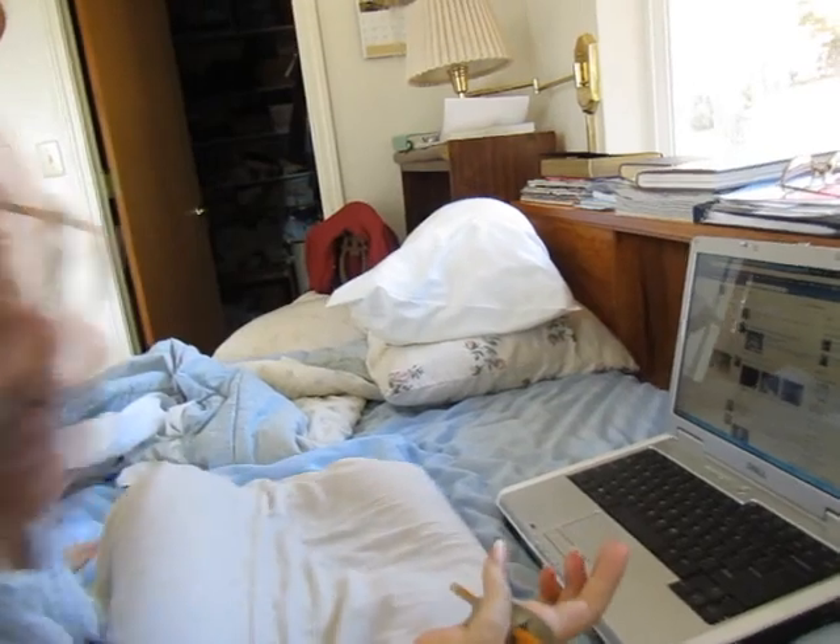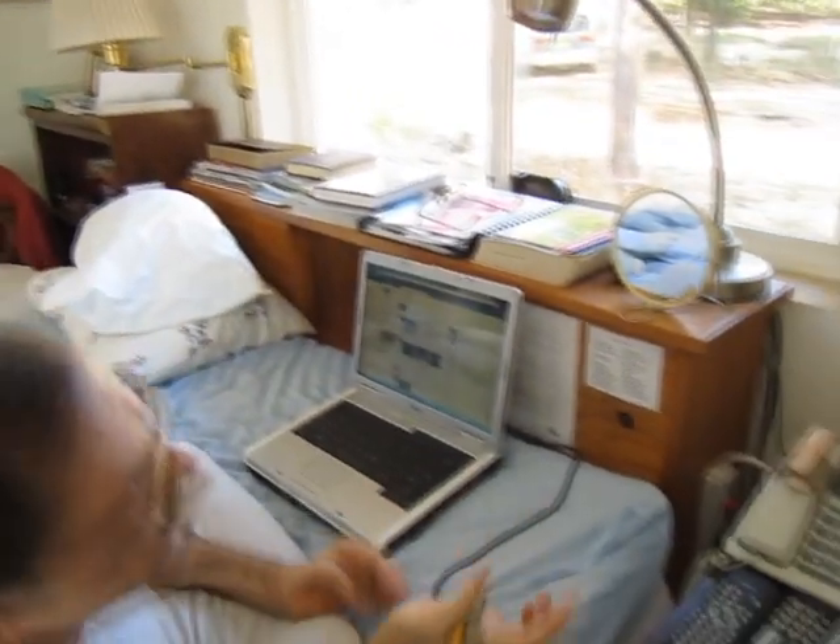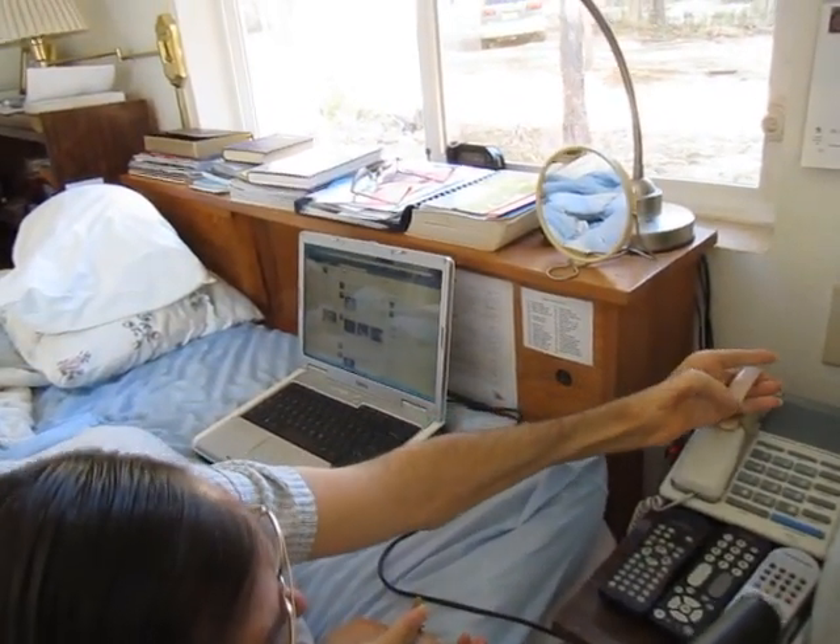The phone just rang. I have a special handle on it that I can just grab it like this and talk.